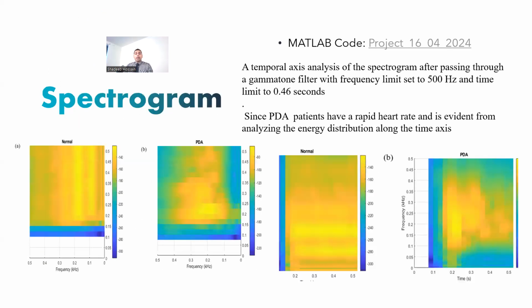Thank you again. As you could see clearly, I'm just ending with this note that there is clearly a distinction in the spectrogram for a patient with a normal heart and one with a PDA.